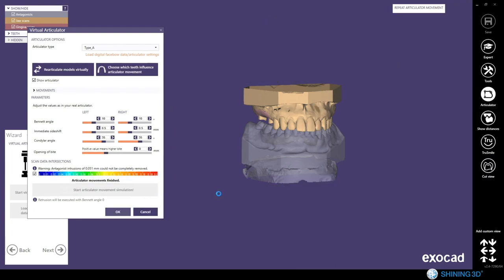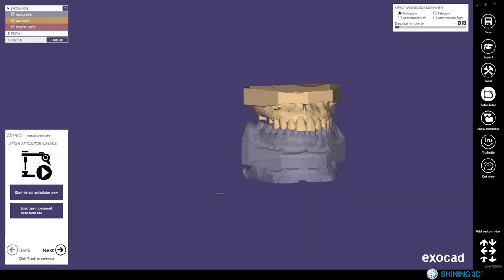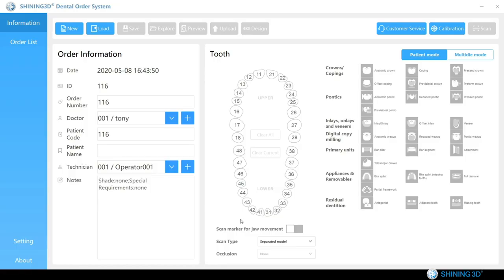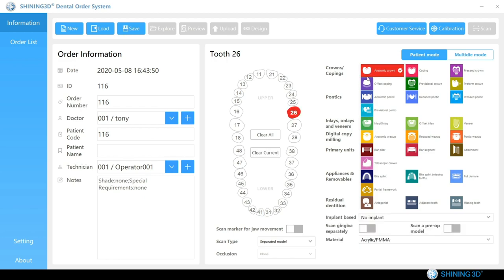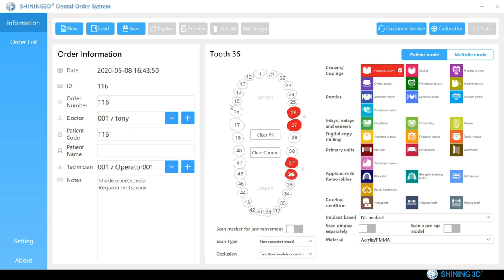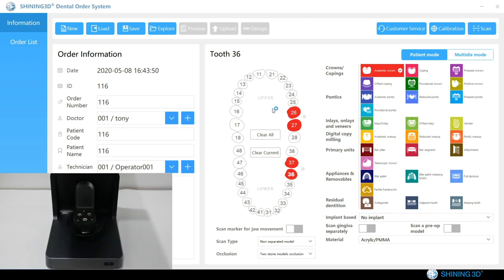Click OK. Third case, non-separated models, scan is all in one function. First, create order 2-6 anatomic crown, 2-7, 3-7, 3-6, and select non-separated model, choose the models, occlusion, save, click scan.